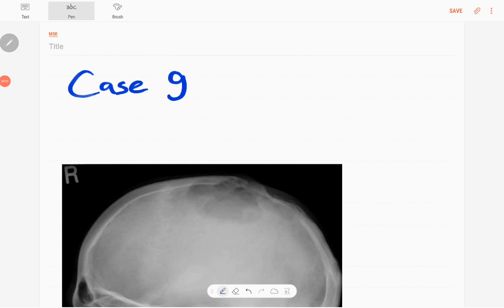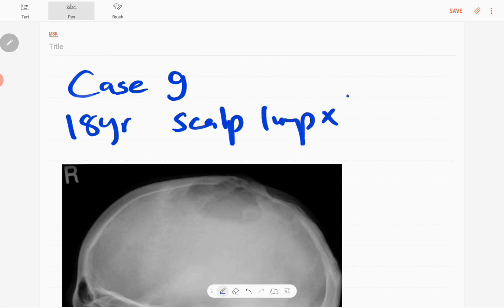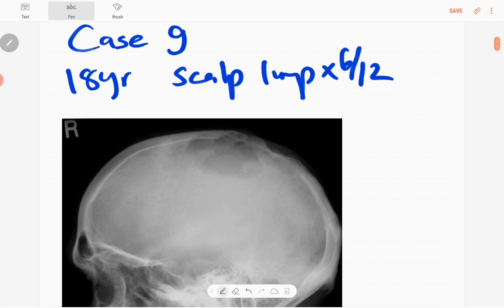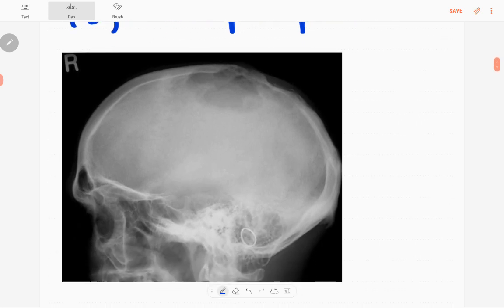Hi everyone, this is case number nine of MSK series. This case is an 18-year-old patient who presented with a scalp lump of six months duration. It is progressively increasing in size, and this is the lateral radiograph of the skull.